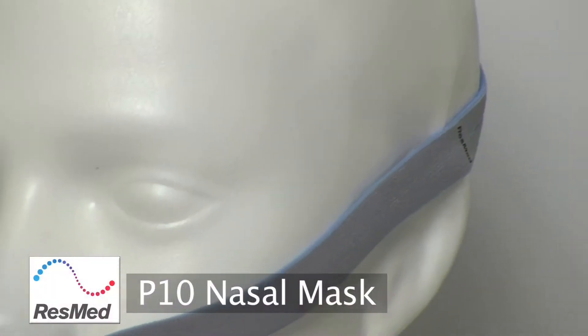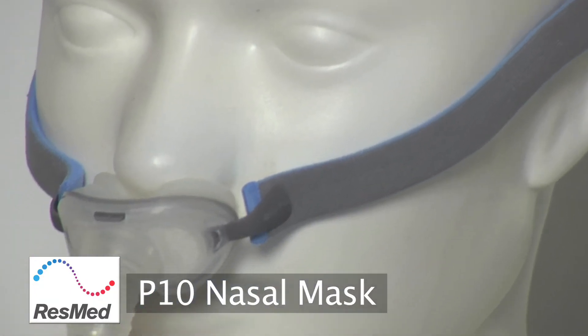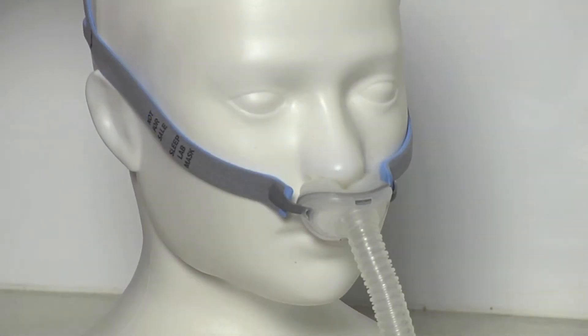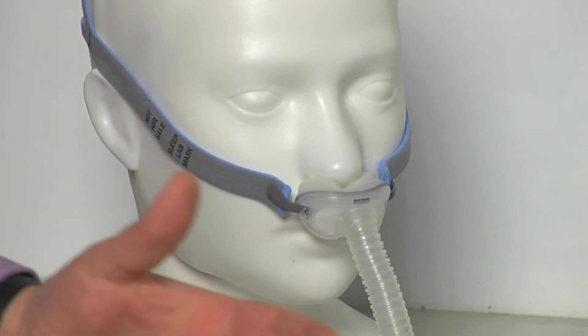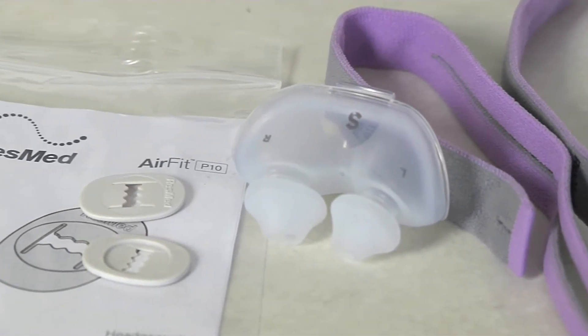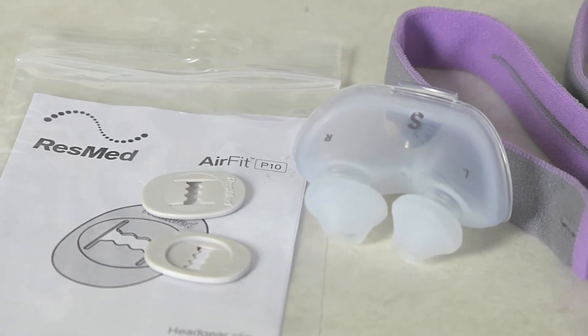Andrew from Sleep Right Australia here, and in this video we're going to show you how to change the components of the P10 mask. After a little while this headgear will stretch — it is a very soft stretchy headgear. It will stretch eventually, but the good part about that is it is replaceable. The second part of the mask which can soften and become damaged is the pillow component which sits in the nostrils.